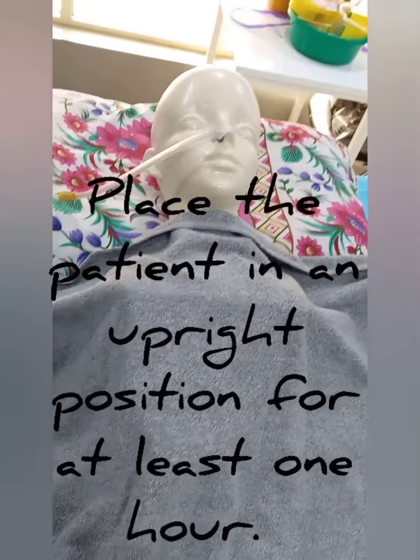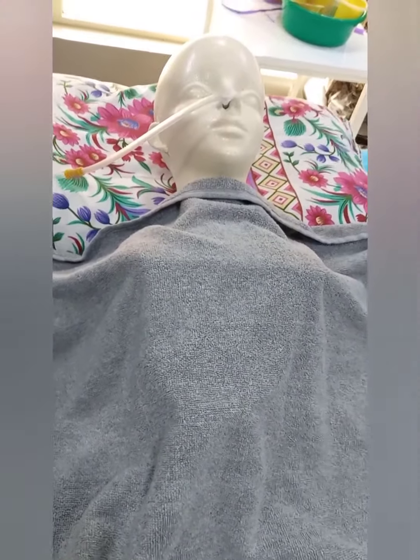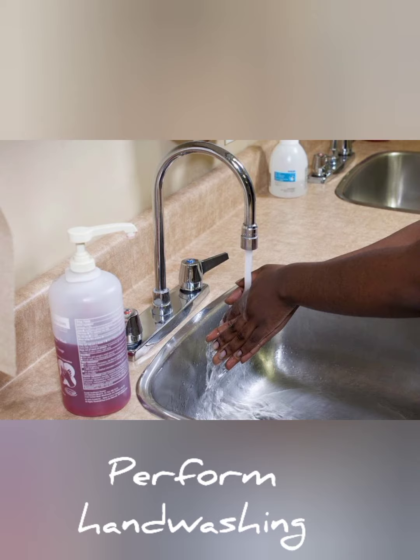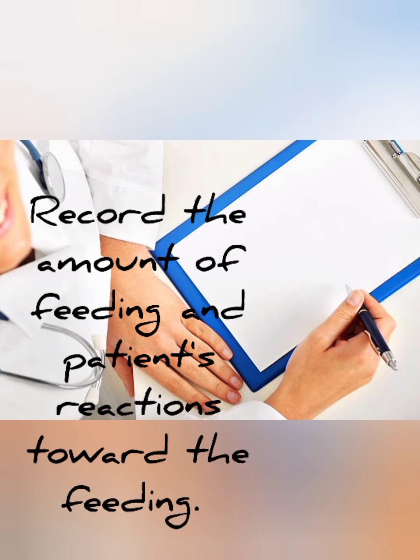Place the patient in an upright position. Return all supplies. Perform hand washing. Record the amount of feeding and patient's reaction toward the feeding.